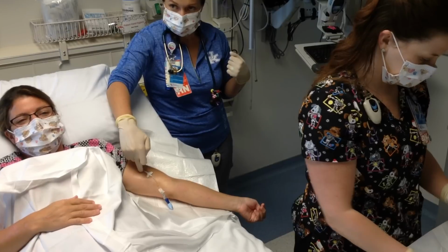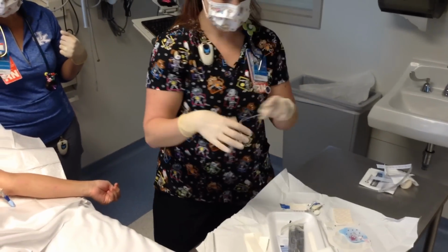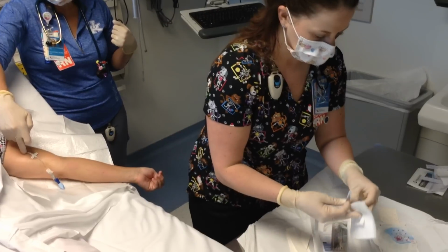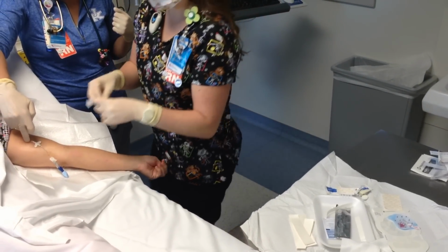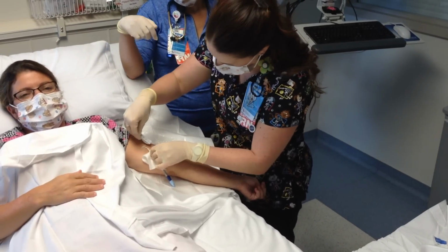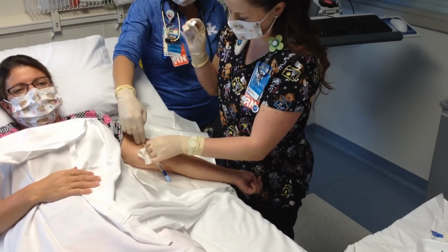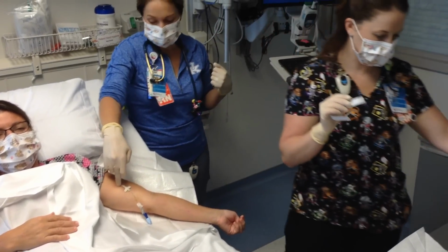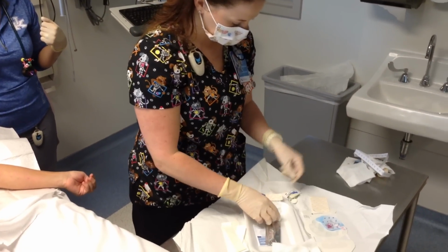So the next step would be to measure the EVL. You want to compare this measurement to the measurement that you looked at in EPIC prior to your dressing change. If the EVL is less than the last documented EVL, you can pull the catheter back to the last documented EVL. If it is greater, you just need to continue with the dressing change. You don't want to ever push a PICC back in. Our EVL is 2, which is correct. Anytime I'm going to be touching this catheter, make sure you use a gauze and that gets trashed. Anything that you've used gets trashed outside of your field.